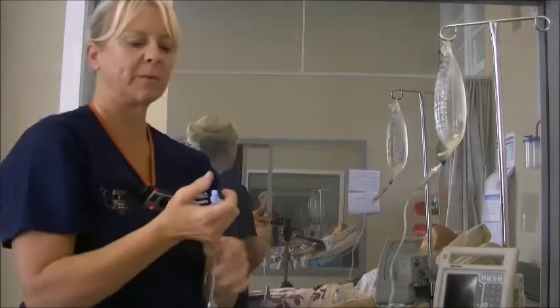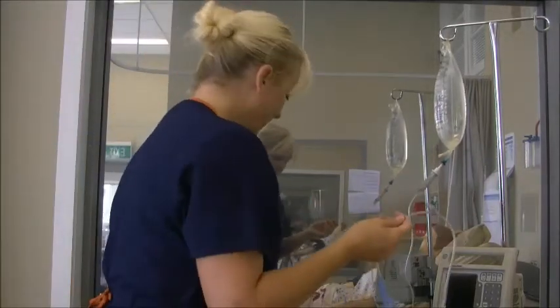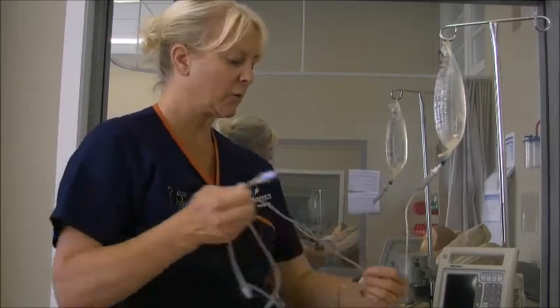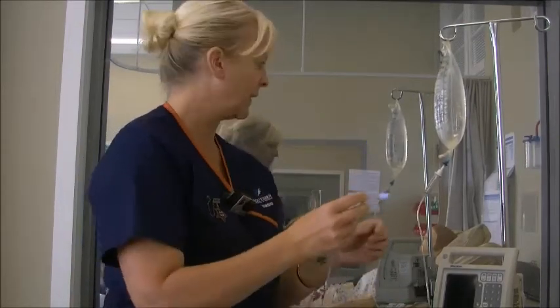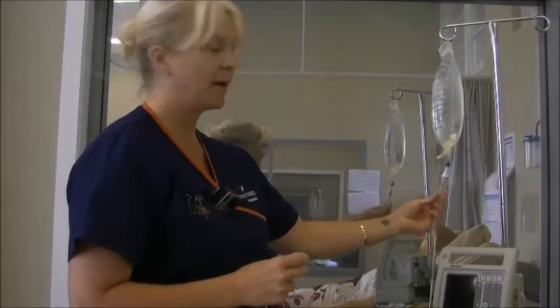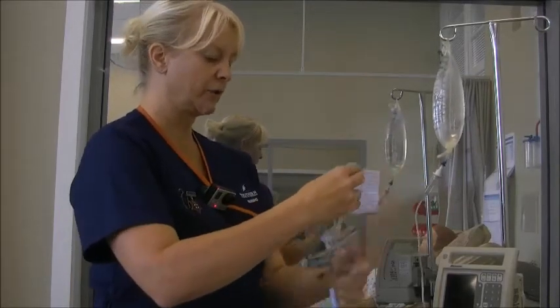Okay, so at this point, because the roller clamp is turned off, the fluid isn't going to go anywhere. So now I can have a good hold of the tubing to make sure that I'm not going to drip it anywhere. First thing I'm going to do is squeeze this little chamber here to about halfway, and then I'm going to let the fluid come down through the tube.